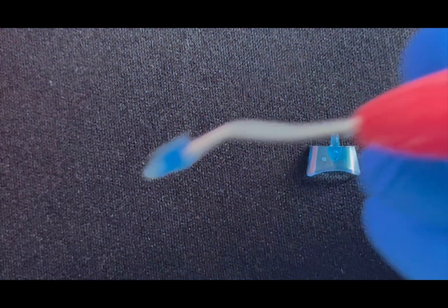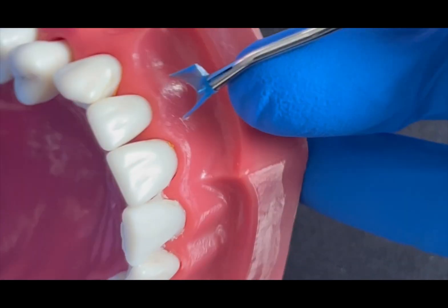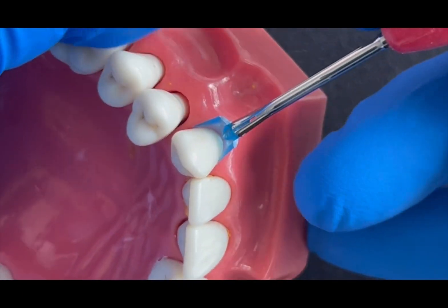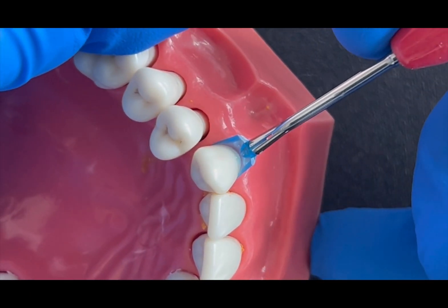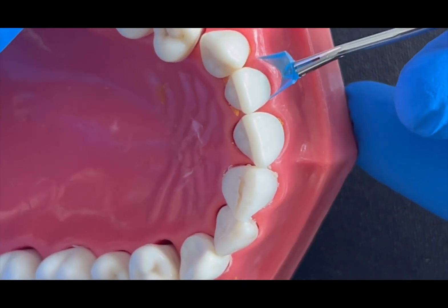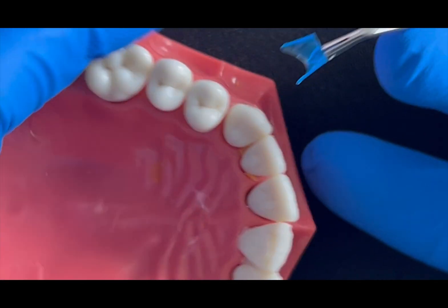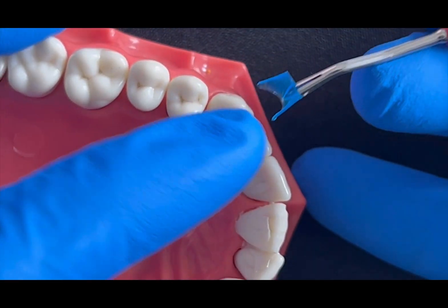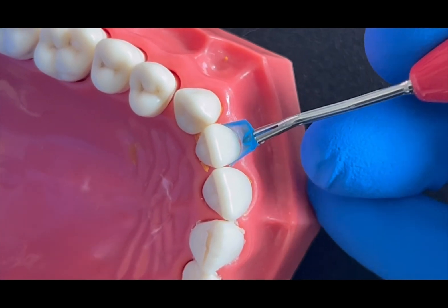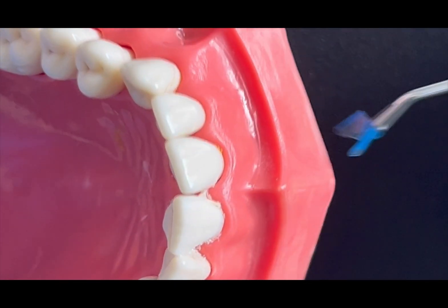I engage it well, and you can fit it into the gingival sulcus. It engages well into the canines, the premolars, and the second premolars as well. Through the lateral you can see a slight gap, so you can customize it by rounding the sharp angles and get it adapted against the tooth. It also fits against the central as well.